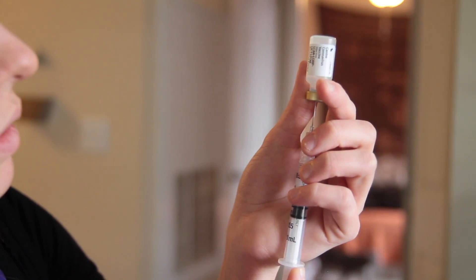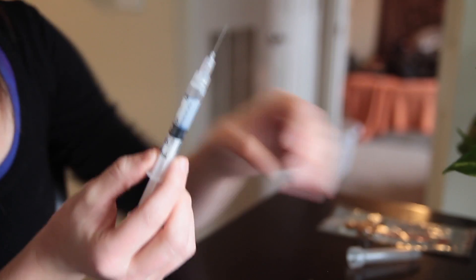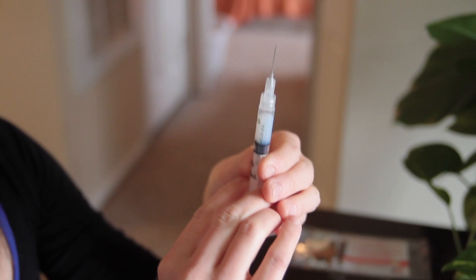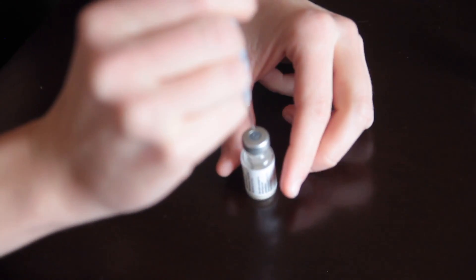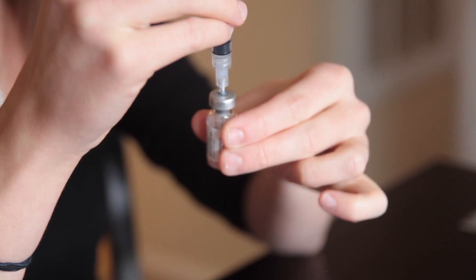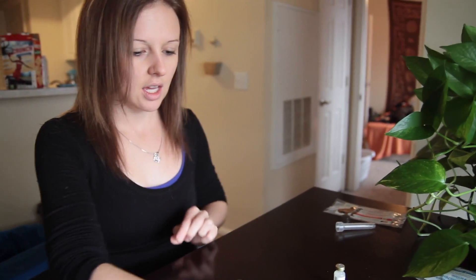There should be no fluid left in the bottle. I can see it going through the neck right now — this is about one mil of fluid. I'm just pushing the air out. You can have a little bit of air, cause now we're gonna put it into the next vial, right into the middle, and push it in. Never recap the needle if you're a nurse, but we're doing this for the dogs, so I'm gonna do it with the proper technique. And it's recapped.